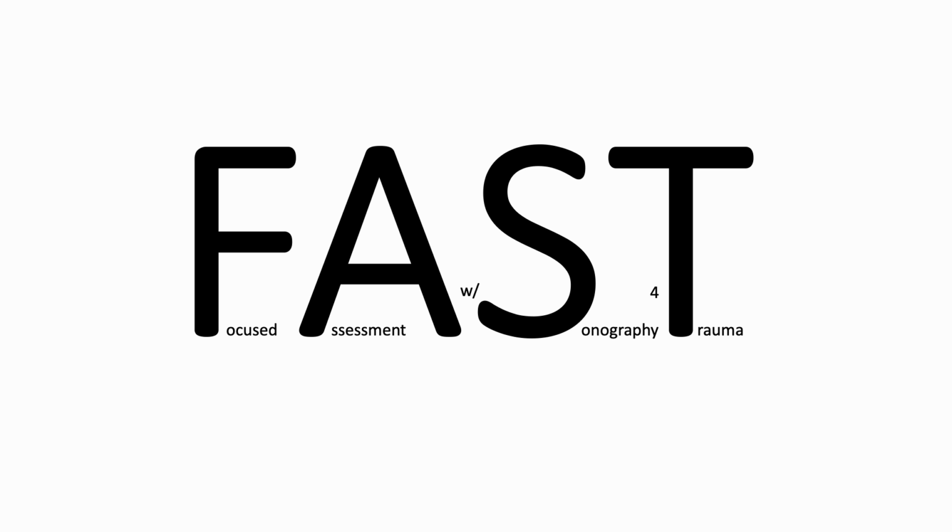So as I mentioned at the beginning, we're going to focus on 2 different studies here, the FAST exam and the IVC. So starting with the FAST exam, what FAST stands for is Focused Assessment with Sonography for Trauma. Now, the acronym FAST also makes sense because this is a rapid study. We should be able to perform the study in probably 30 to 45, maximum 60 seconds to help try to uncover some immediate life threats or make some diagnoses in the patient in front of us.